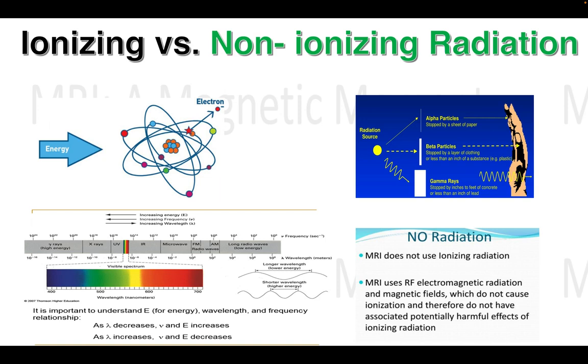And there comes in the advantage of MRI, when its non-ionizing radiation capabilities supersede the other two diagnostic imaging modalities, because X-rays and CT utilize ionizing radiation to obtain images. So it's one of the great advantages of using MRI over other modalities.